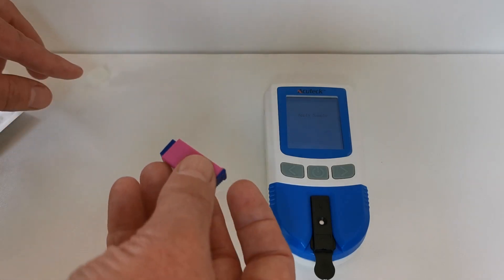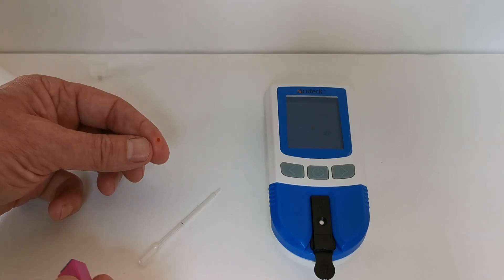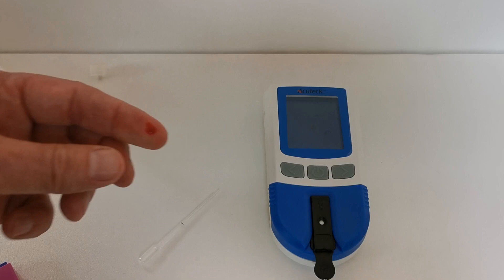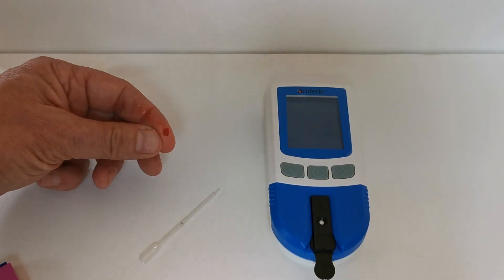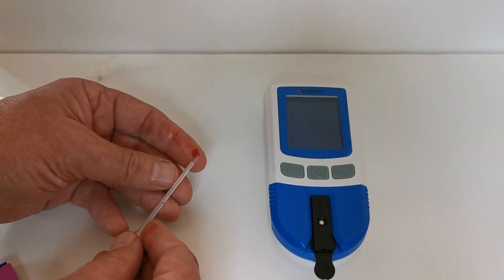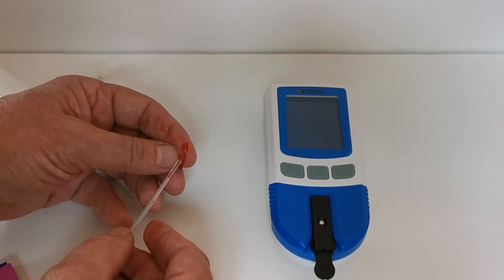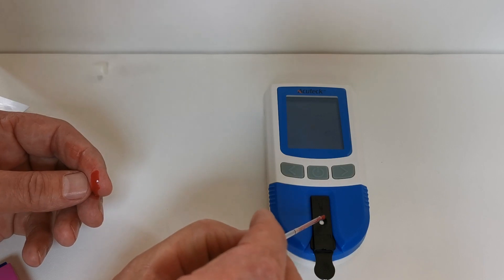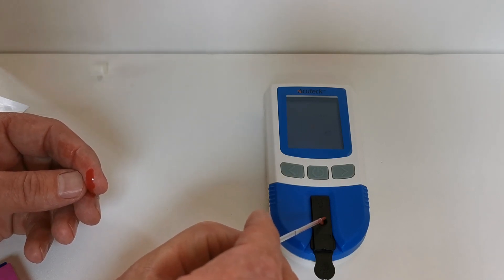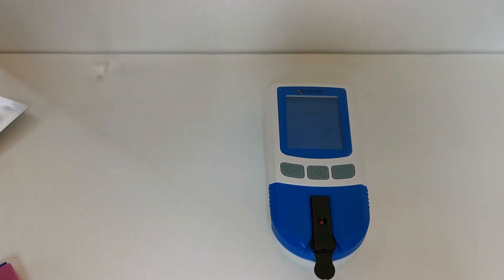We're now going to use one of the safety lancets to get a sample of blood. Wipe the first droplet away, then squeeze the finger to allow a good second droplet to form. Using the pipette, put it sideways and allow it to naturally fill. You can see it does so, and as soon as it reaches the black mark it should stop filling. Then squeeze the pipette into the sample well to apply the sample — and there we go, that sample has been applied.